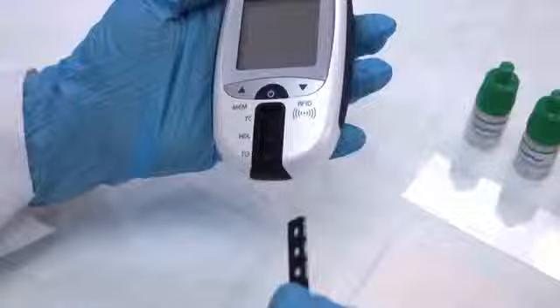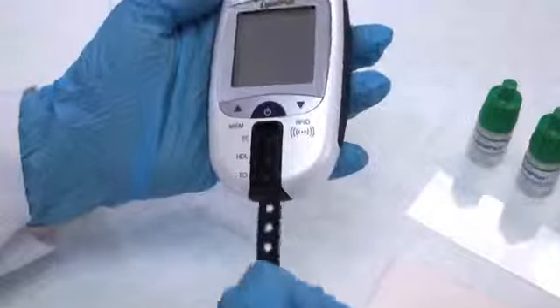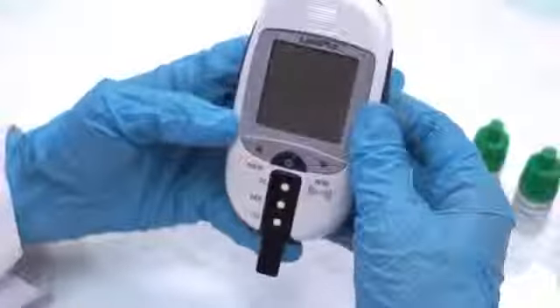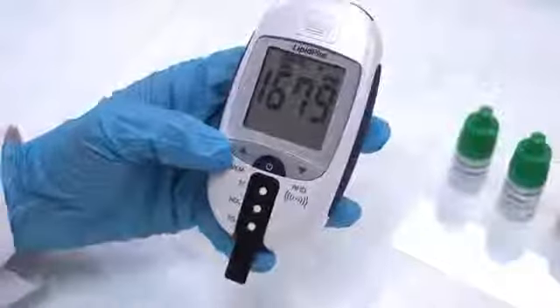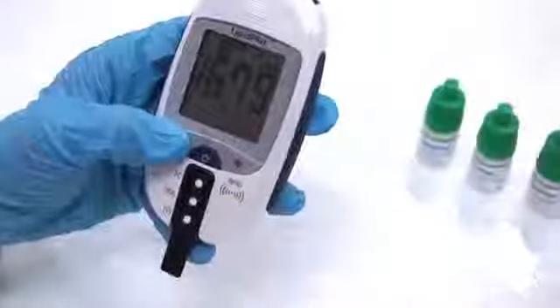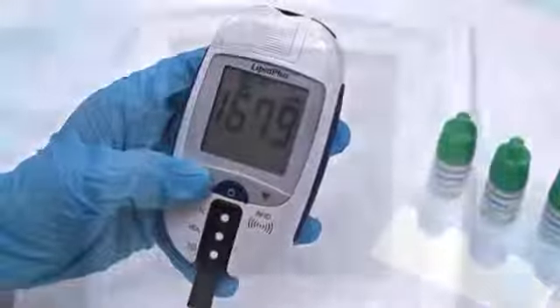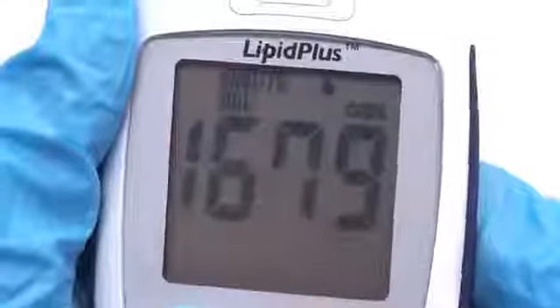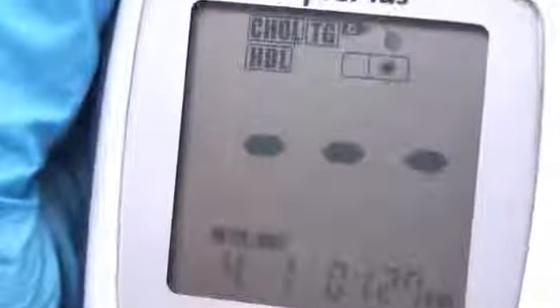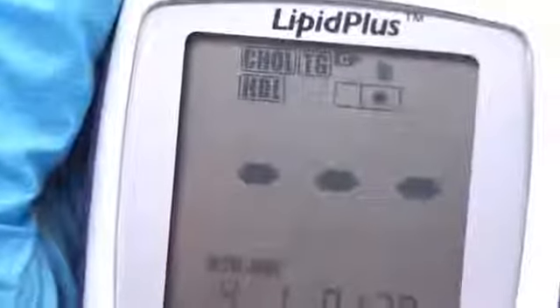To begin testing, insert the lipid profile test strip and press the center blue mode button. The code displayed should correspond to the RFID code on the strip vials. Immediately press the up button and the analyzer will display the control solution symbol. In 5 seconds, the sample blood symbol will blink and you may begin control testing.